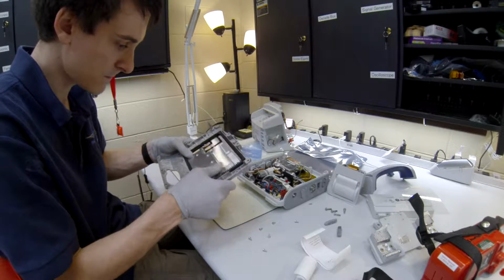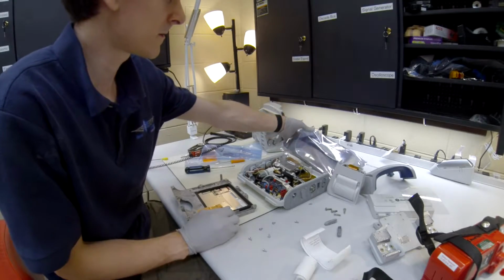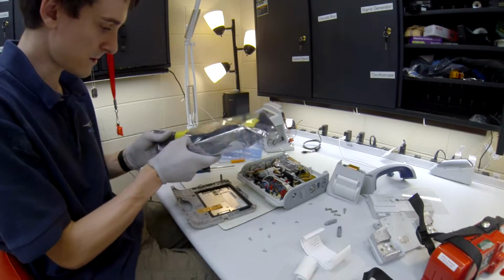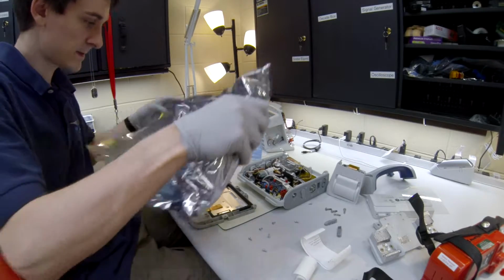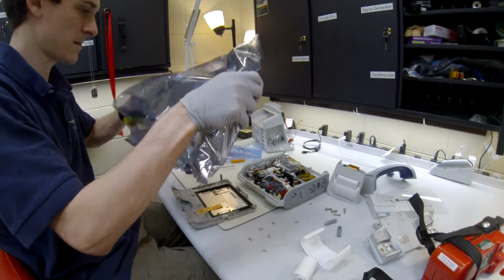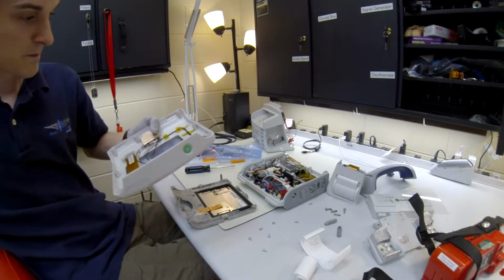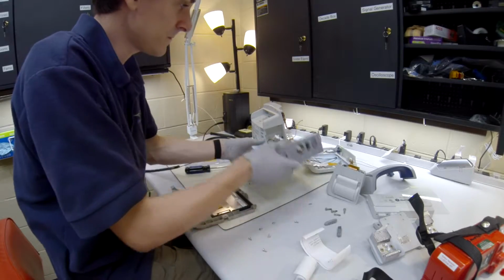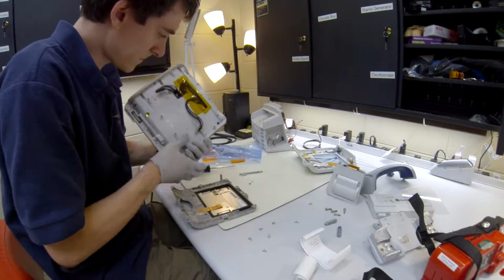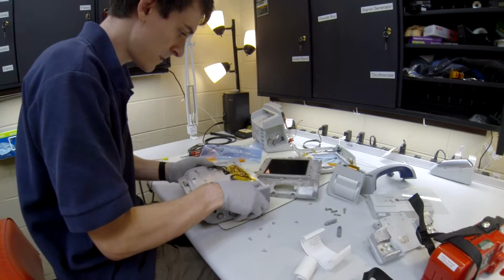I'm going to roll this tape back up, and we're actually going to have to get a new face plate here since we broke the last one. They broke the last one, not me. Okay. So I'll put this piece back in here.